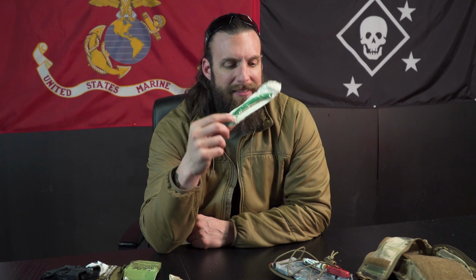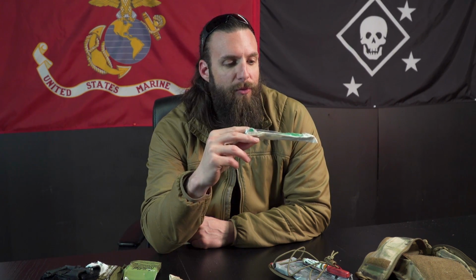If you have a hard time getting this in, sometimes you just put a little saliva in your mouth, get it a little wet, and it'll slide right in. If you're hearing a little crunching, you're hitting that cartilage, just tip it a little bit more. Put the nose up, go straight back and down, you'll be good to go. But so, bleeding, airway, we have to breathe.